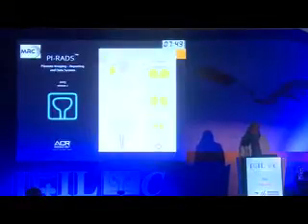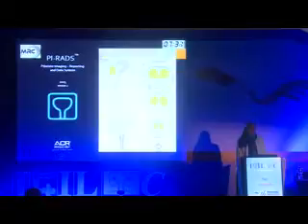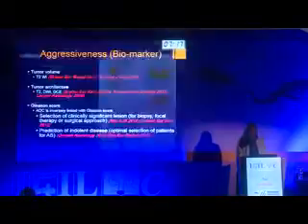Recently, we rely on the PIRADS scoring for assessment of prostatic carcinoma. In version 2, published lately, we divide the prostate not only into the three major parts we mentioned earlier, but actually into 39 zones, and this is the map where we are assessing every single portion in our imaging, including morphological and functional assessment.